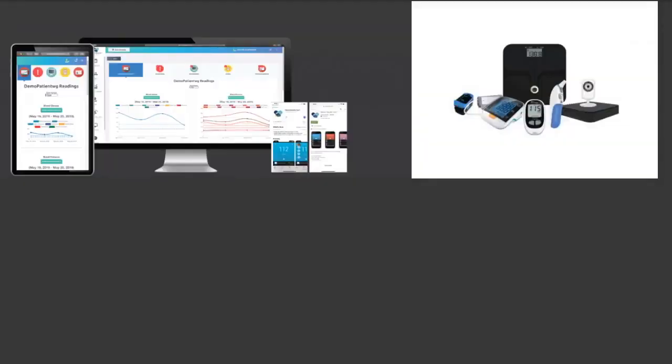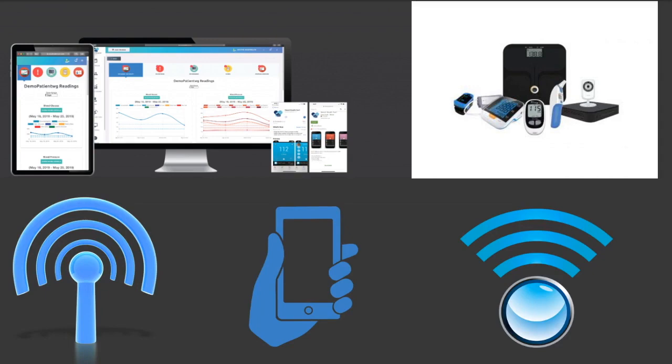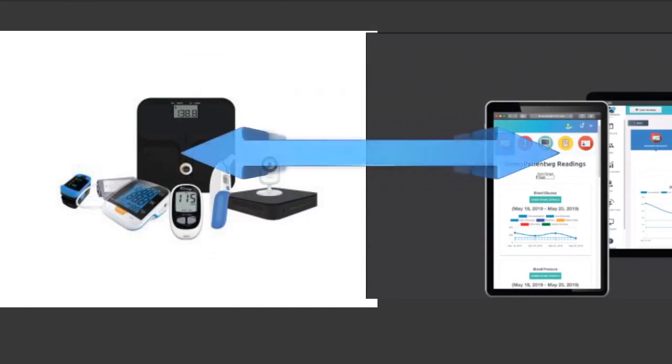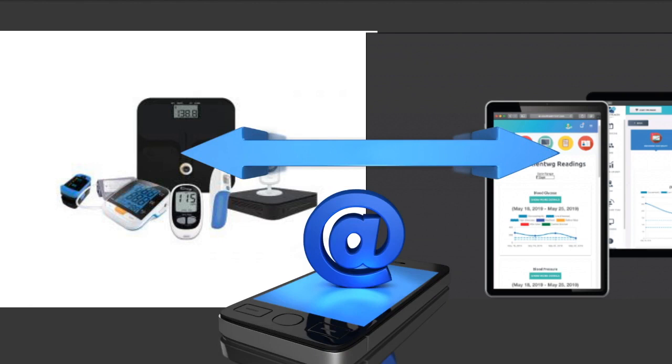Our platform and devices provide the ability to capture and measure diagnostic data remotely through Bluetooth, cellular, and wireless technology. The devices are provisioned to help pair on your first transmission, meaning they will sync to a user account right out of the box through the use of our mobile application, downloadable at the Apple App Store or Google Play Store, and runs on smartphones, tablets, or TV.